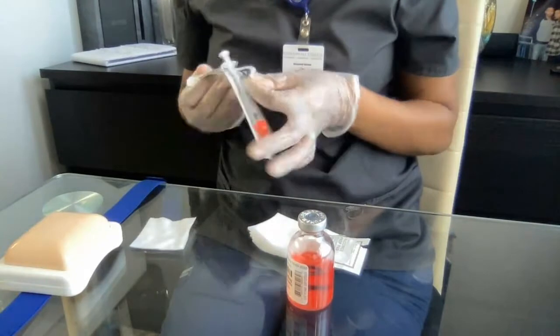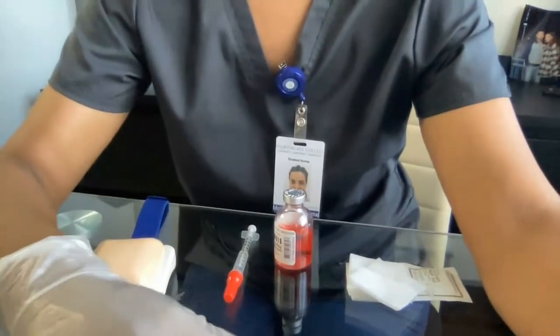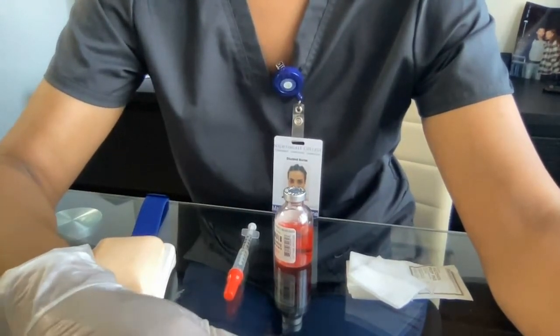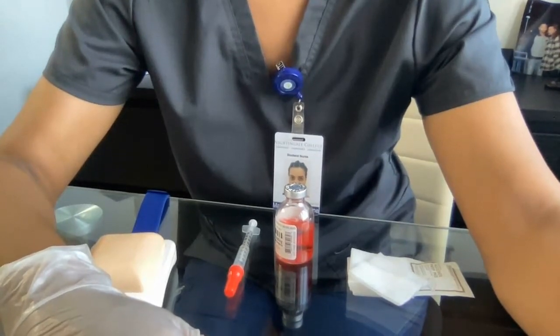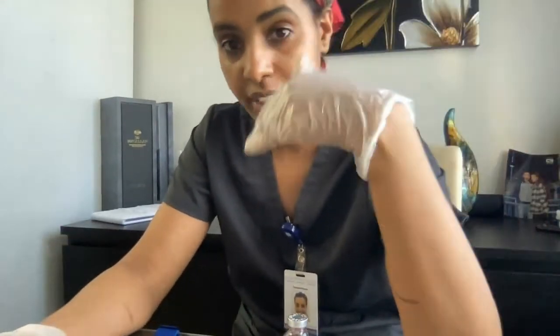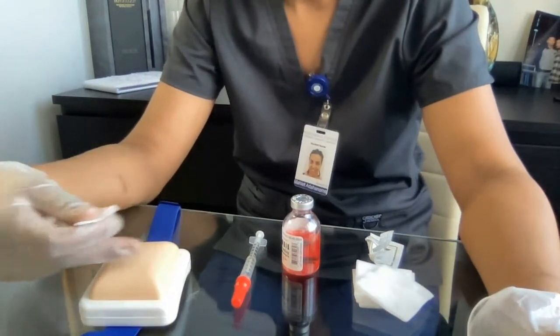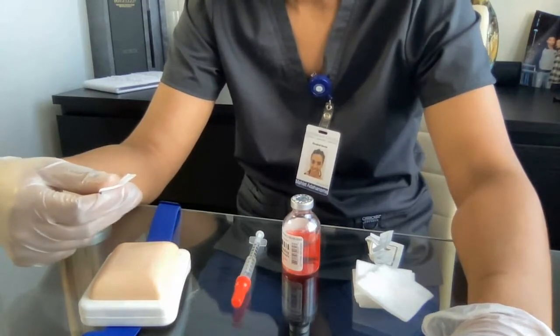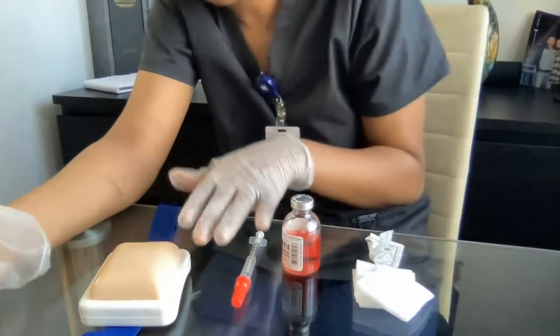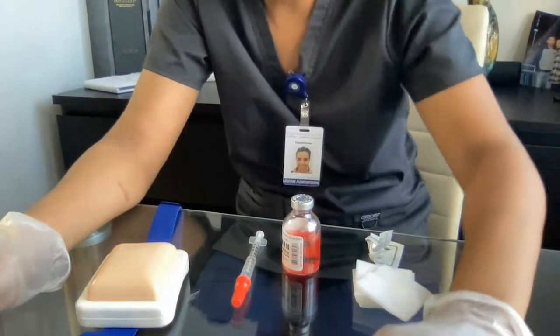I have my medication and my syringe ready. Now I'm going to let my patient know they might feel a little burning or stinging sensation at the administration area. Before administering, I'll check the site for any discoloration or lesions, and palpate for tenderness. If I see anything abnormal, I will select another site for injection.